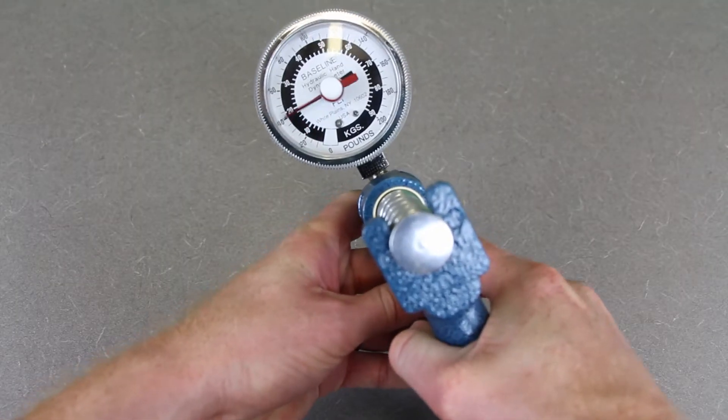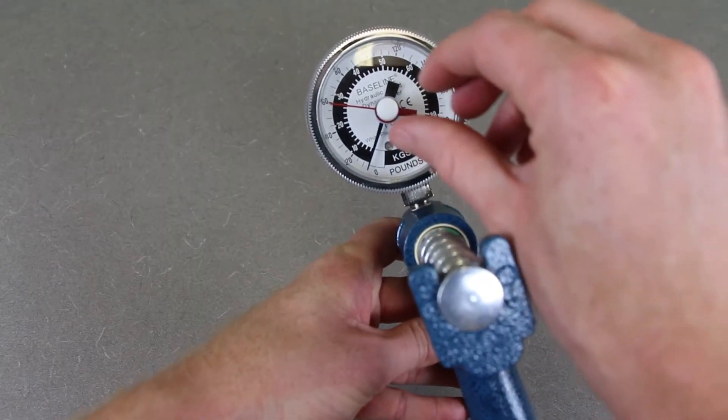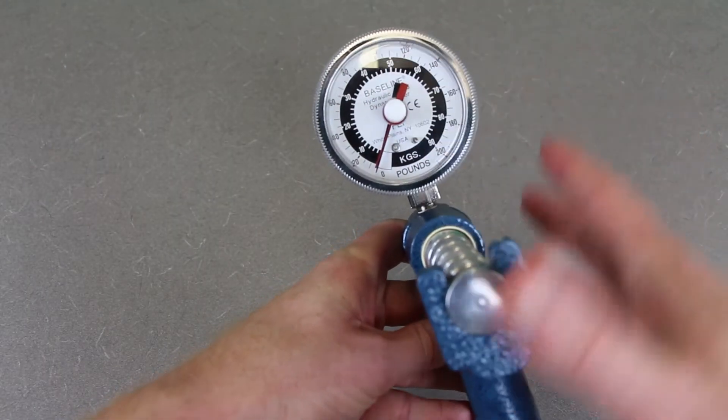For this one, there are actually two needles — a red needle and a black needle. The black needle moves according to whatever you're squeezing at the moment, so right now you can see it's down to zero. The red needle goes up and stays wherever the highest force production was for that last trial. In order to do another trial, you need to twist the white knob to get it back down to zero.